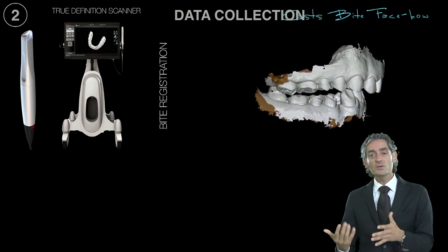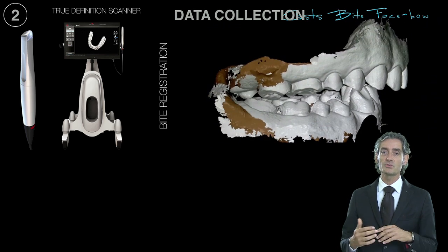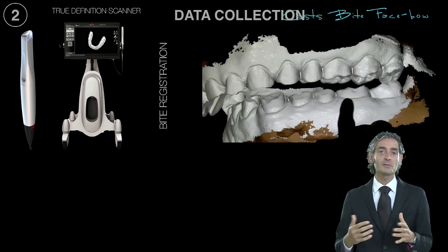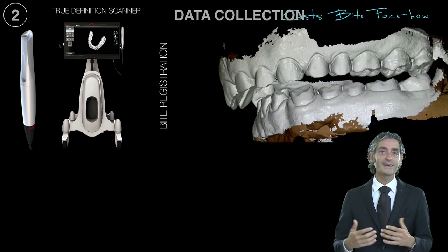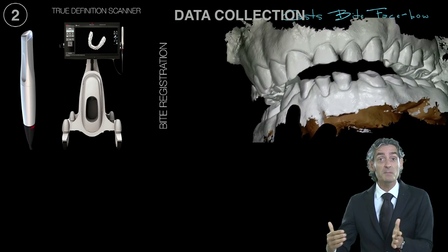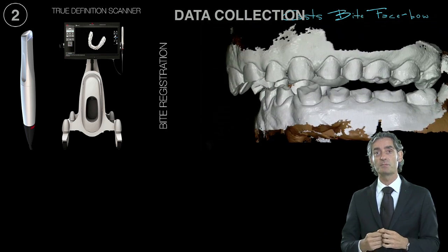And with the new technology, it's easy for us right now to check the space and evaluate the position, every single detail, before starting any kind of digital workflow or other kind of therapy, and we can explain much better to the patient what kind of problem we have.